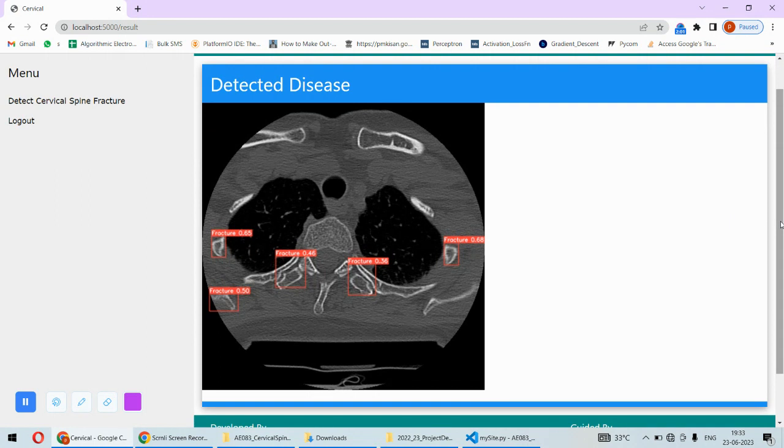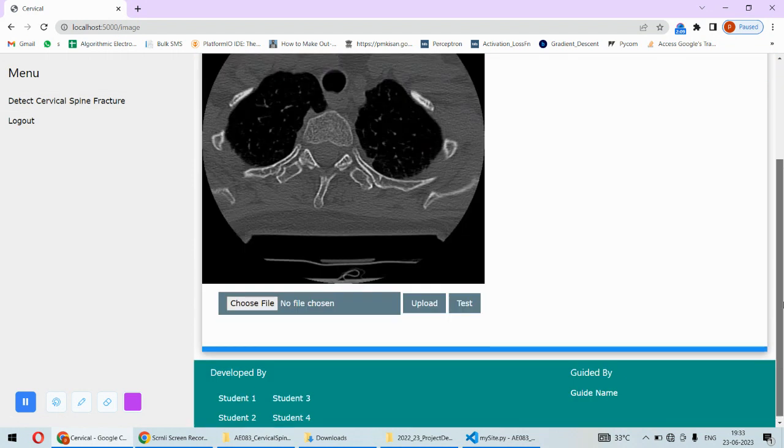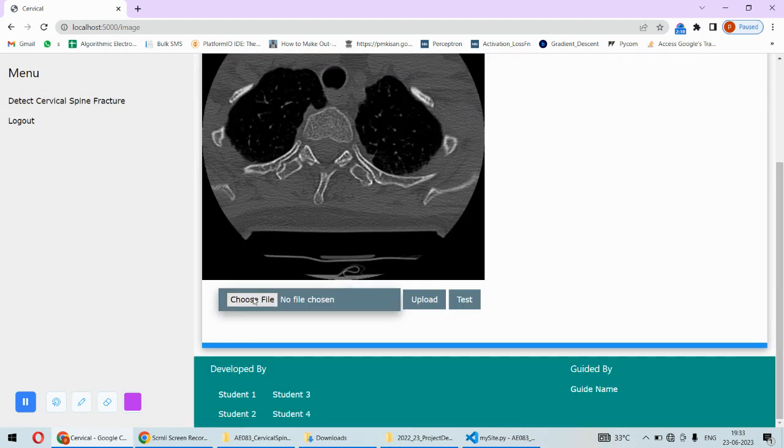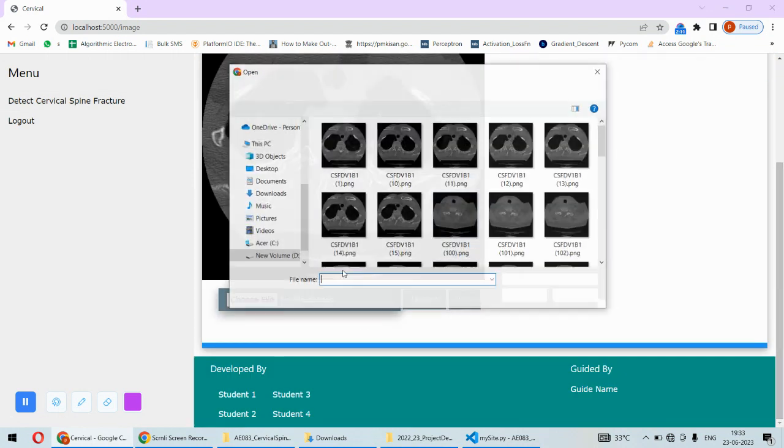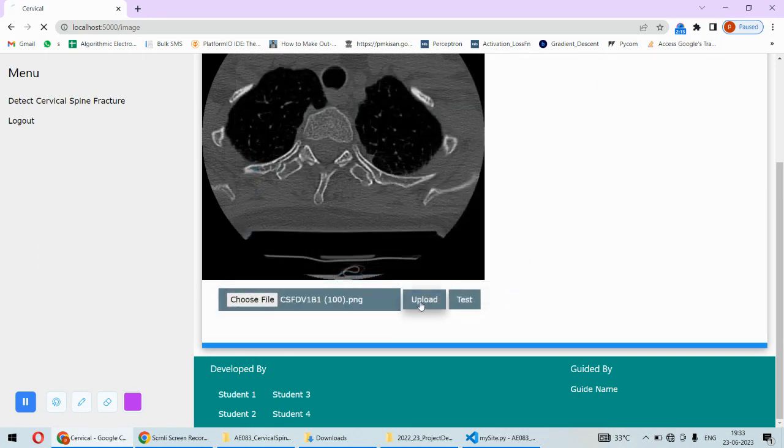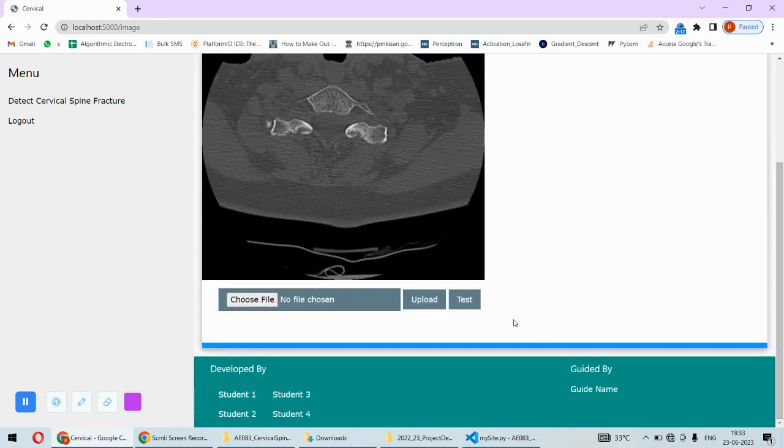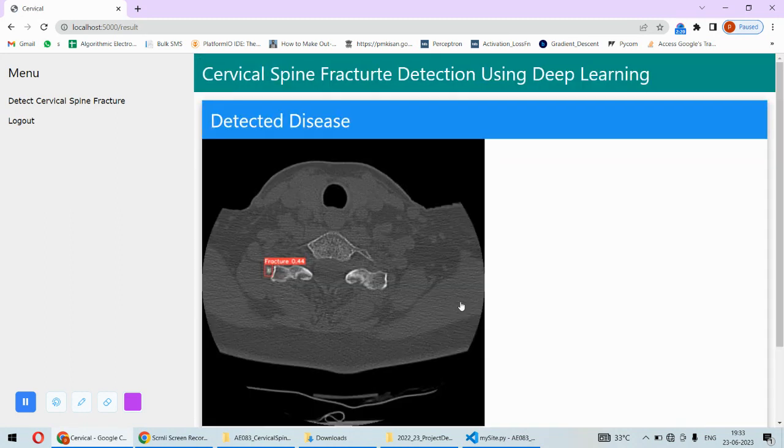We have trained the YOLO object detector on our system. Again you can pick another image as well. This time let's use this image and then upload and test. Again for this image, this is the fracture region which is identified. That way the fracture can be calculated or it can be estimated.